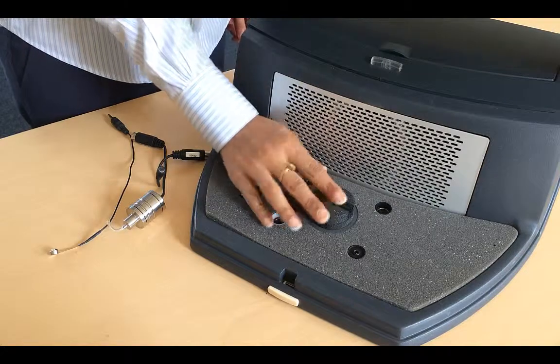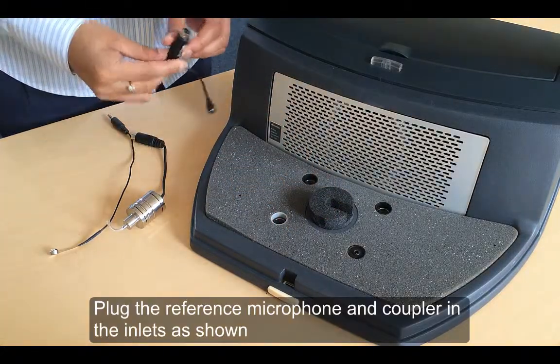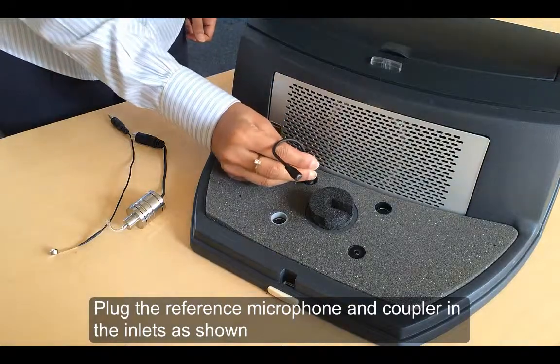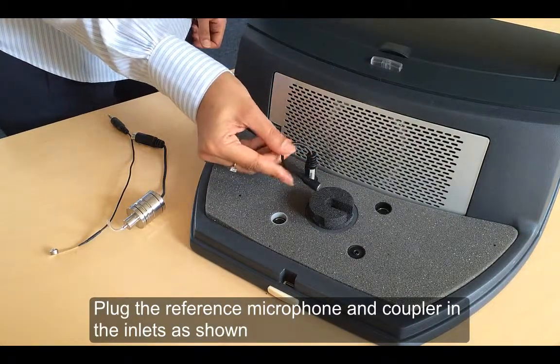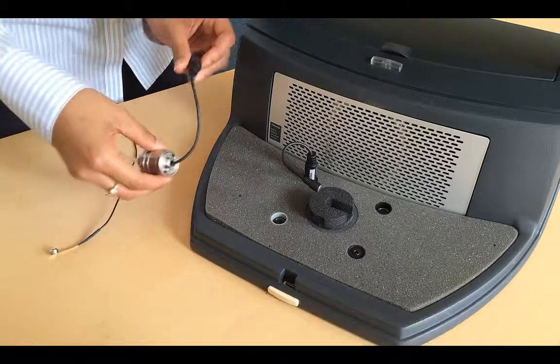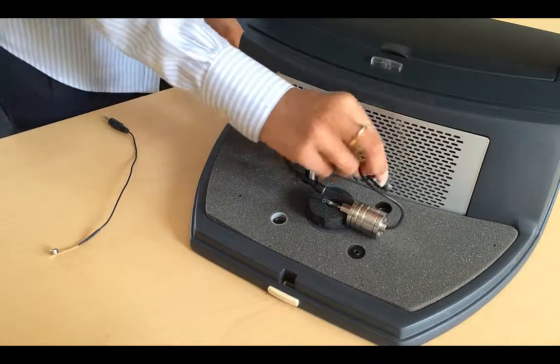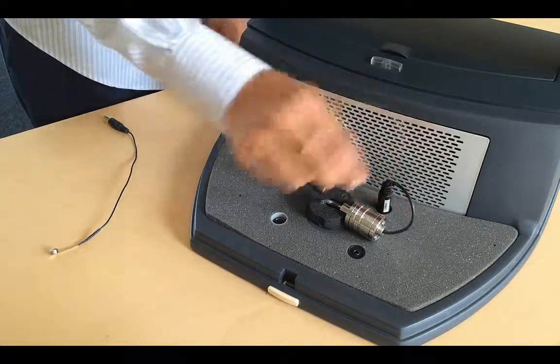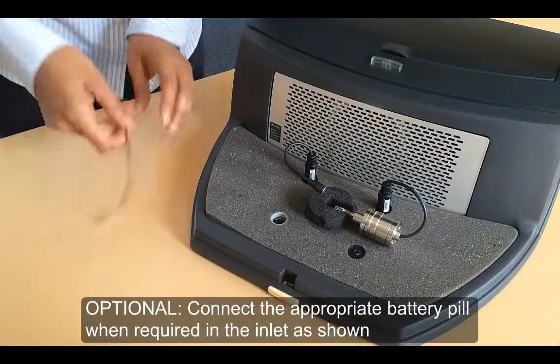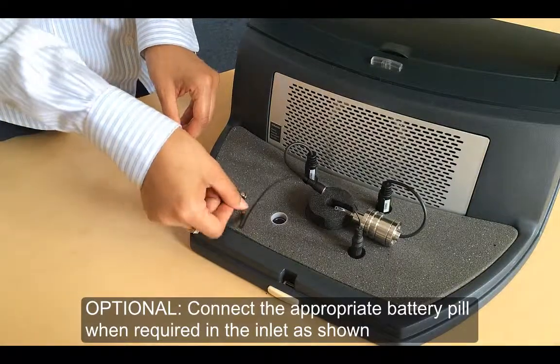Place the sponge in the middle of the unit. Now plug in the microphone and coupler as shown. If you wish to use a battery pill, then plug it into the unit as shown.